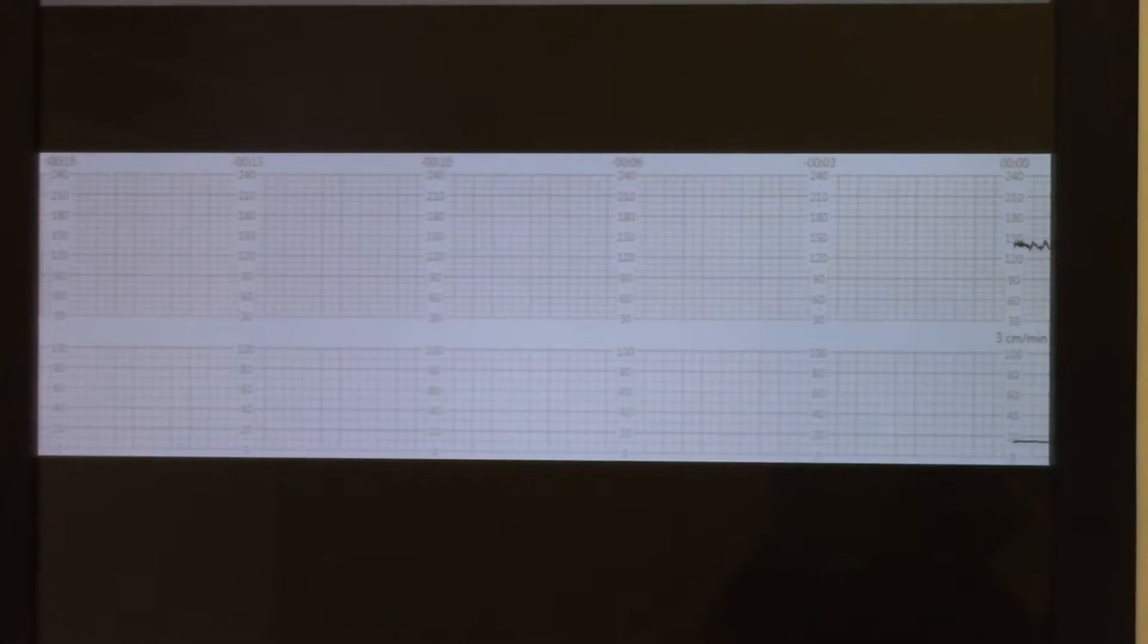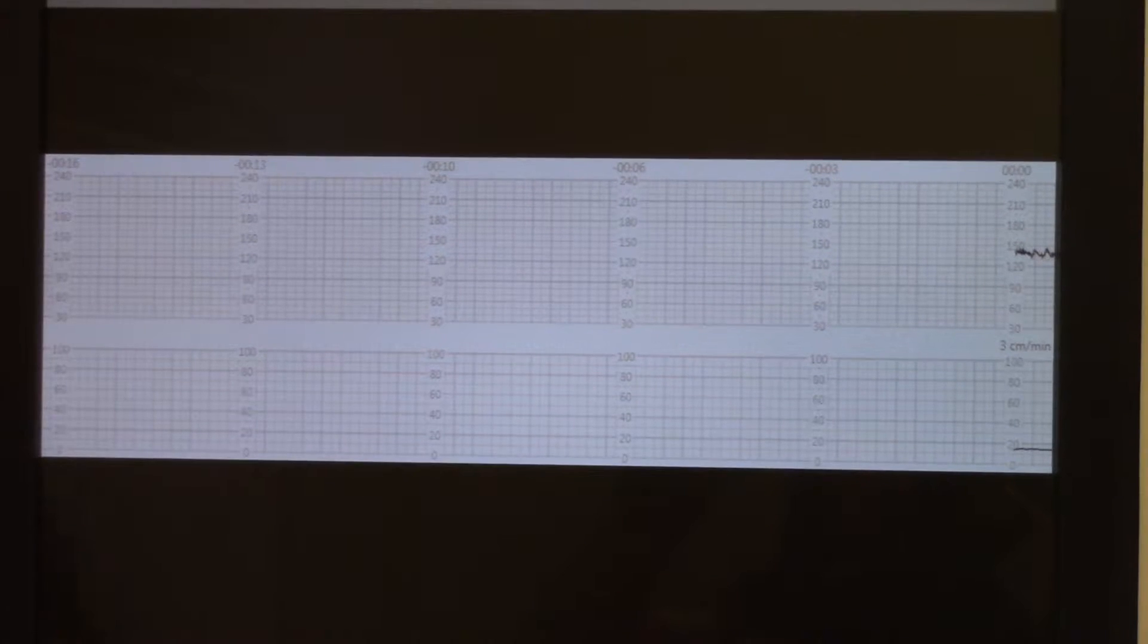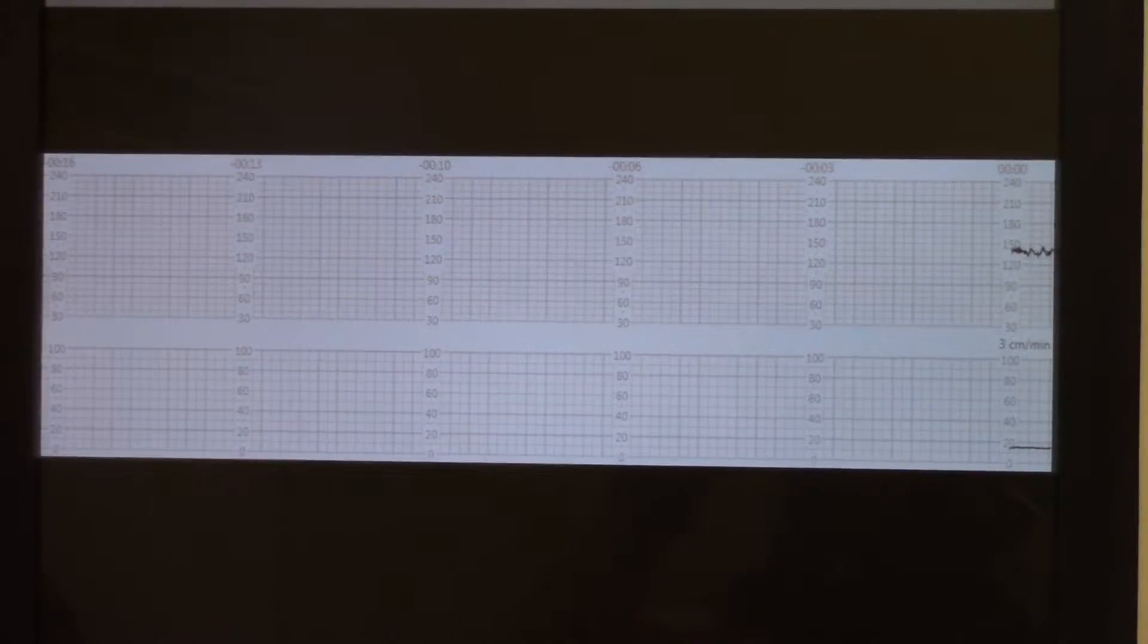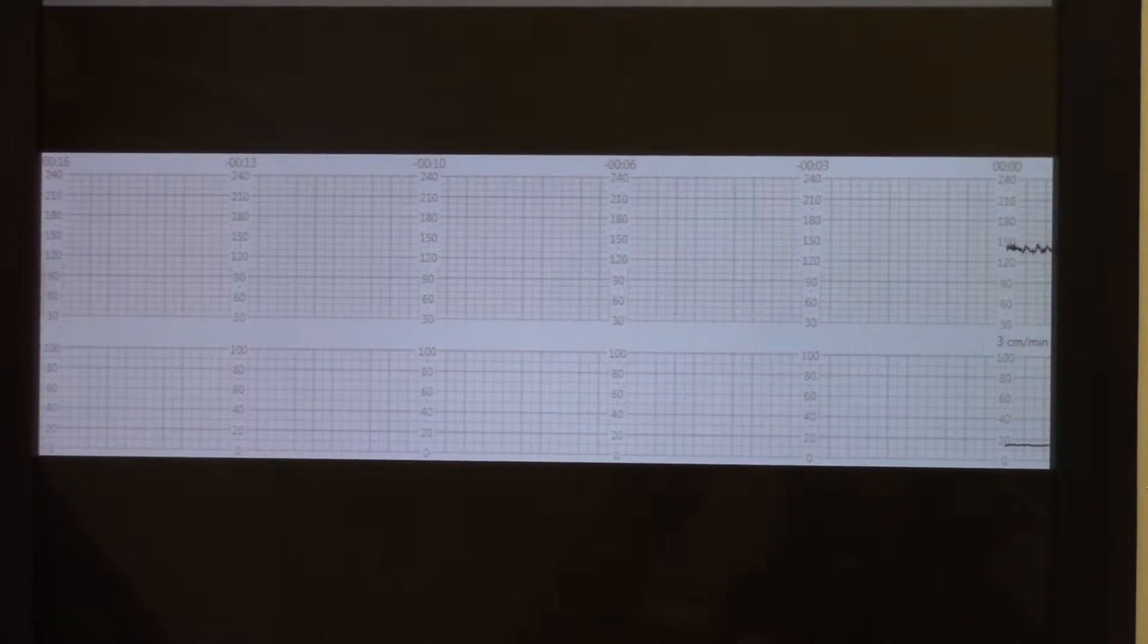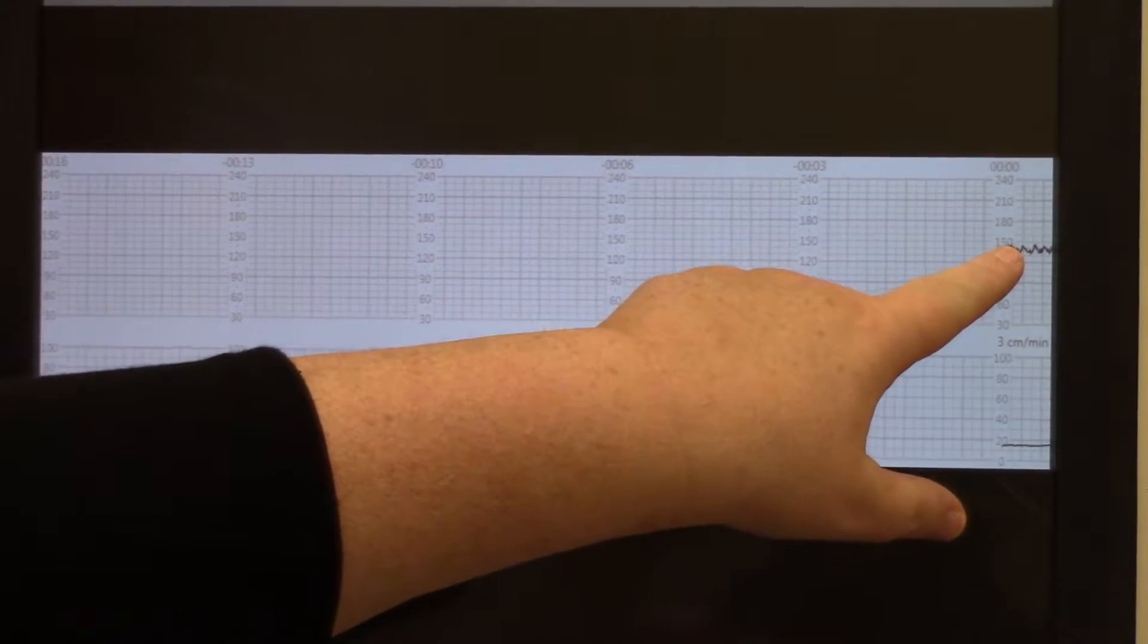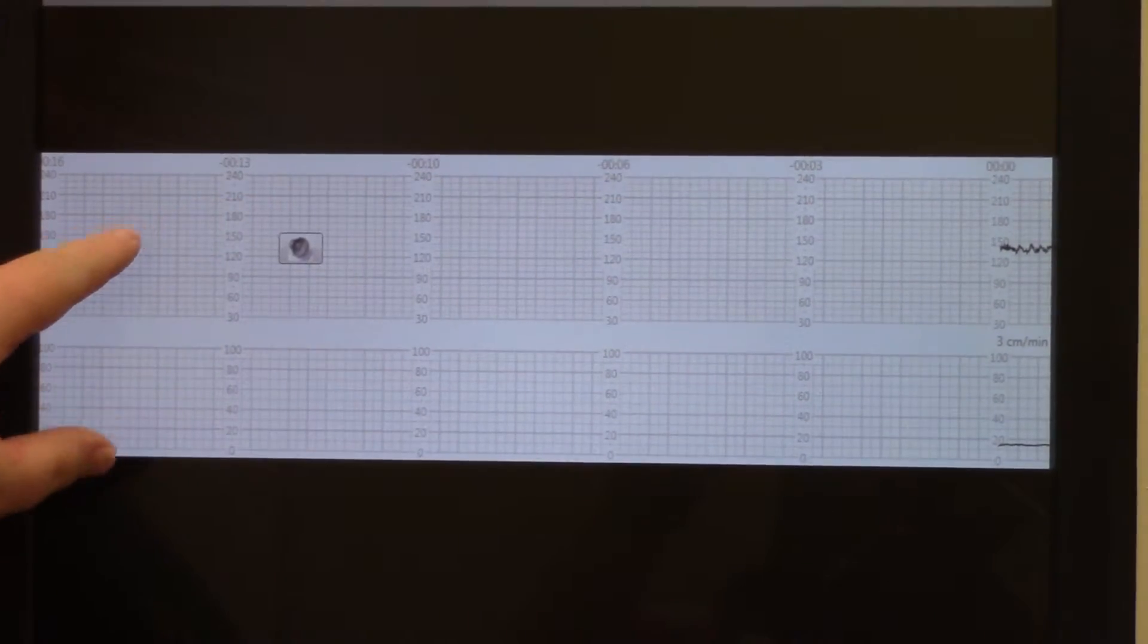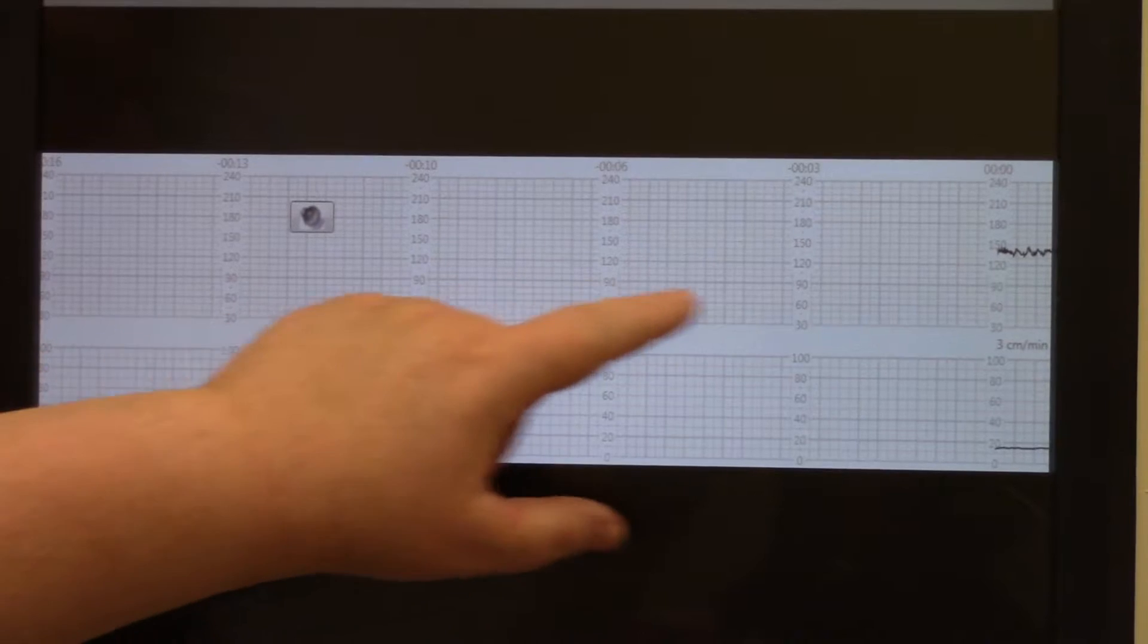Now you're looking at the fetal monitor tracing and you can hear the heart rate. This is the fetal heart rate that you're hearing, and that corresponds to the numeric value here on the top of the screen. Remember, this is the baby's heart rate, and this is the uterine contractions.